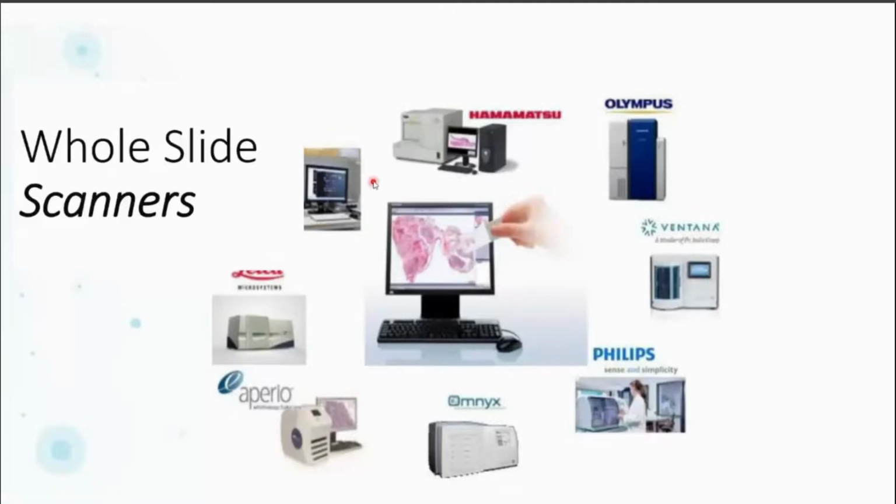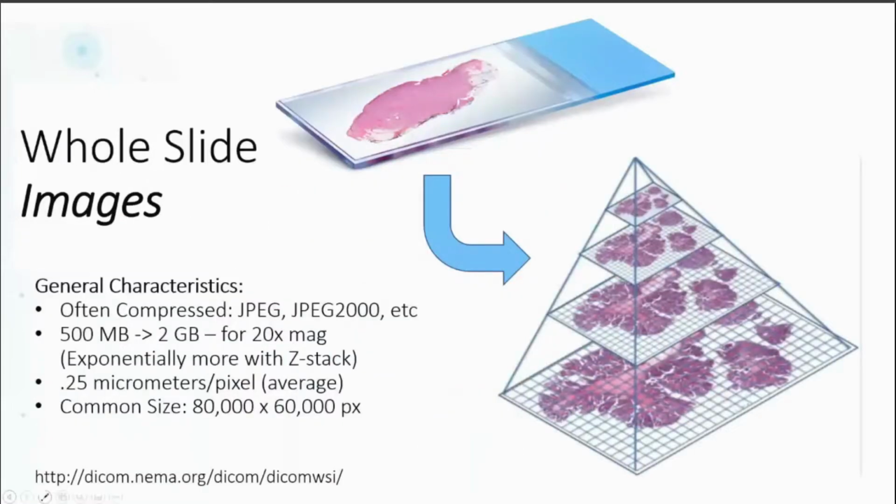Although at the center of it is a fairly standard structure that's been agreed upon over the last 15 to 20 years, that takes the overall base image and then packages that with progressive layers to enable zooming and navigating through what is a very large image.